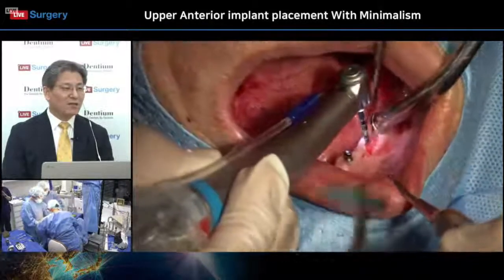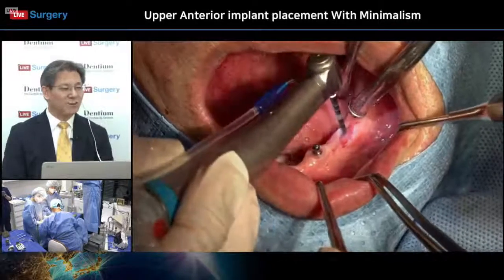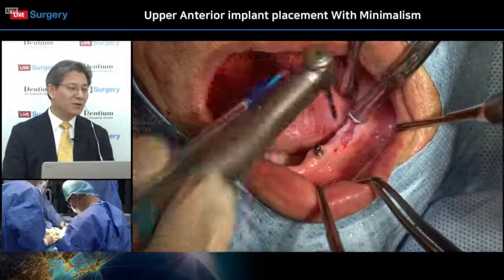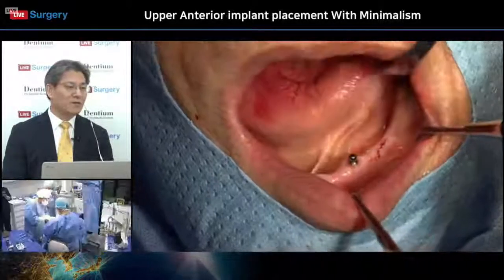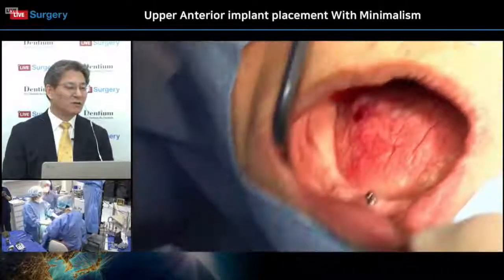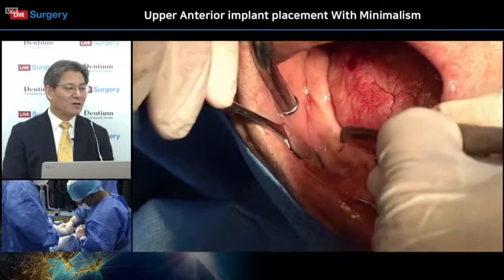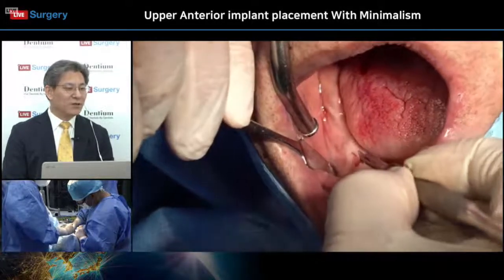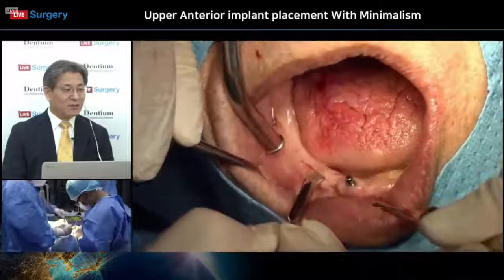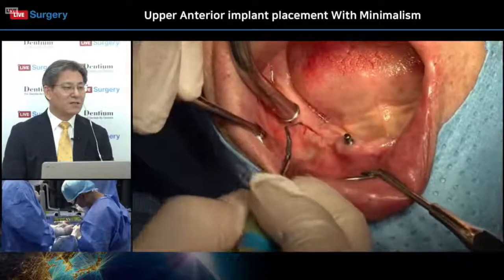But Dr. Jung has lots of experience with implantation in the edentulous posterior, anterior, mandible and maxilla, so it is easy for him to get the proper position and direction. So we need experience. We have to know the bone morphologies of edentulous areas, and the posterior resorption and resorbing areas. So it is a key point to have a proper position when you do implant installation in an edentulous area without a surgical guide or any other helping devices. The freehand surgeries.